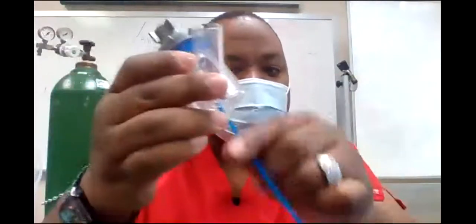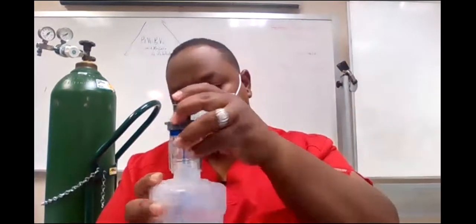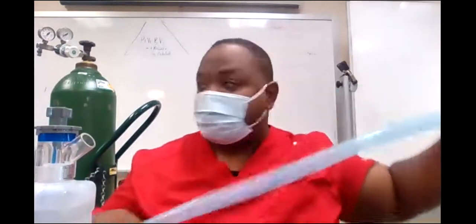This here is the Bernoulli principle. This goes down into the water and sucks up the water and gas through a tube. That's based off the Bernoulli principle, okay? So there are two principles involved with these aerosol setups, the Venturi and the Bernoulli, okay? Two different scientists, Mr. Venturi and Mr. Bernoulli, okay? Now, this goes in here like this, and then you just screw it on, okay? Now, you need one large bore tubing, the first large bore tubing.